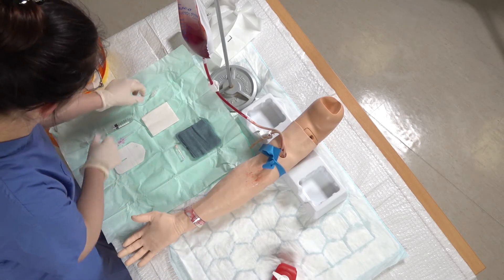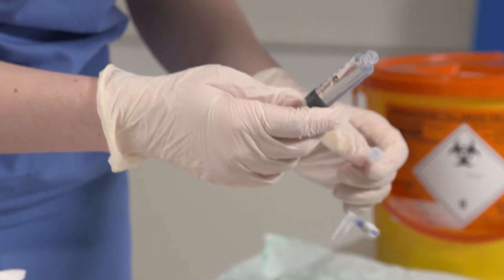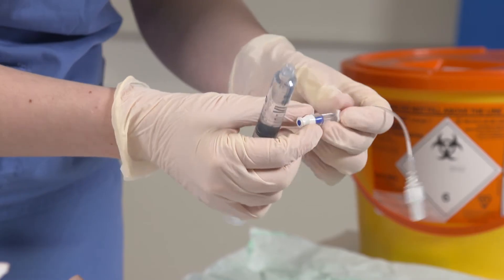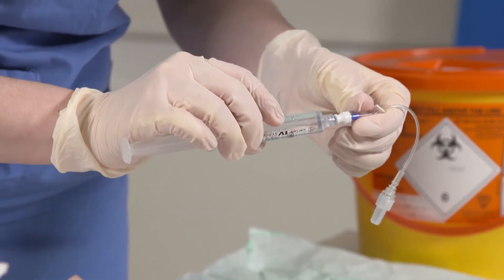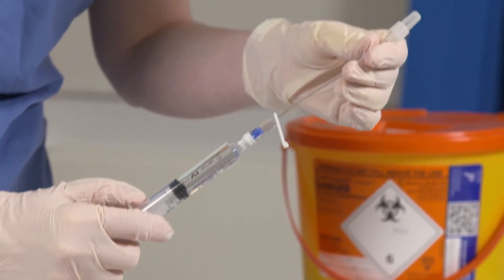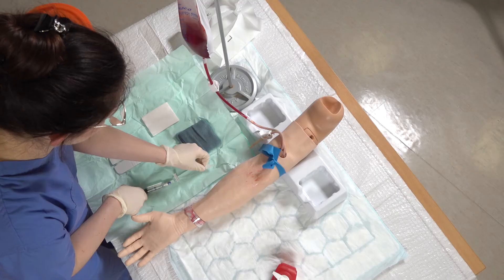While that's drying I'm going to prepare my flush. I've got a 10ml flush of normal saline in my syringe and I've got an extension as well for the cannula. Just going to prime this line, flushing a small amount of saline through it, making sure there's no bubbles. I can set that down.